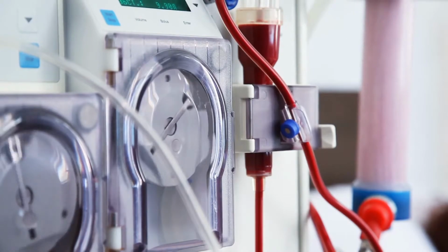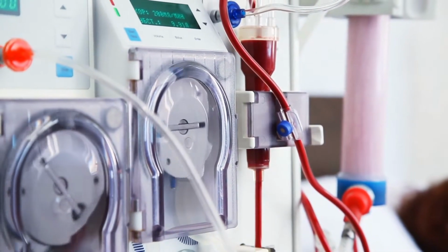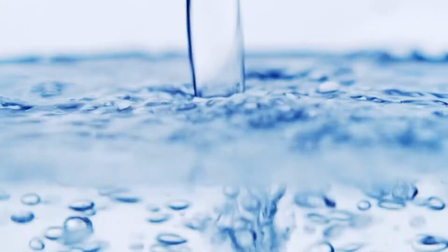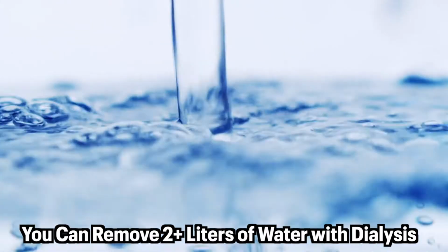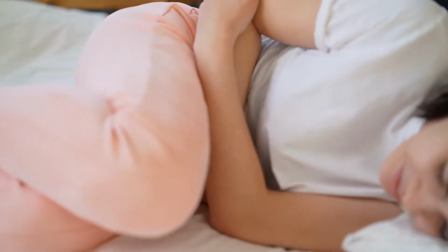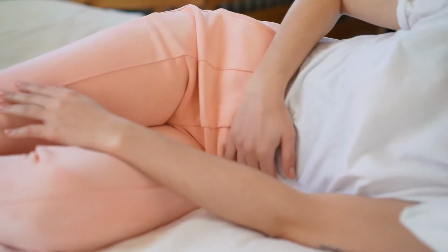By changing the pressure in the system and increasing the pressure on the blood side of the semi-permeable membrane, extra quote-unquote water can be pushed out of the blood. This happens slowly over the course of an entire dialysis session, but you could remove multiple liters of excess fluid. Patients who have too much fluid removed often have severe cramping or very dangerously low blood pressures, so finding the right balance can be very challenging.